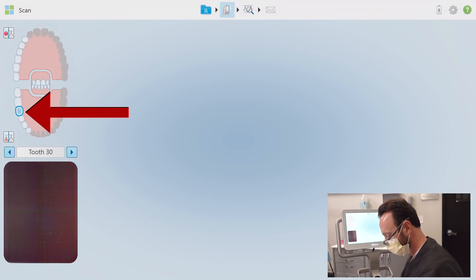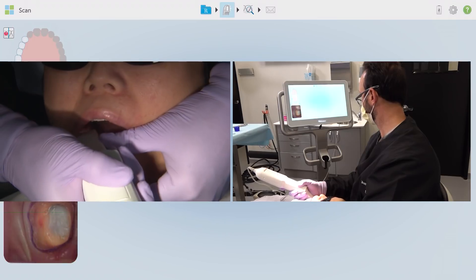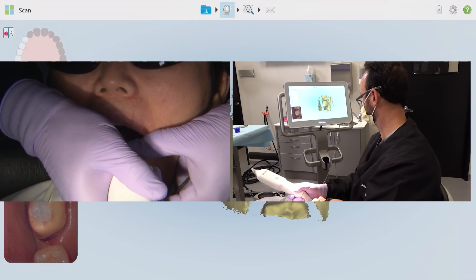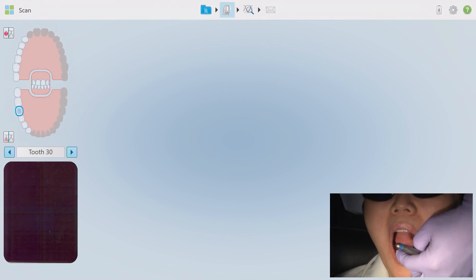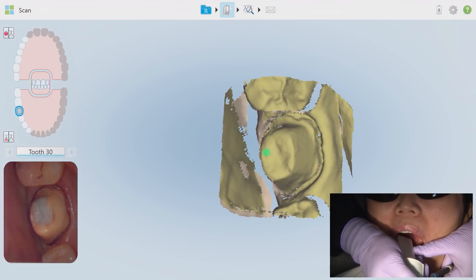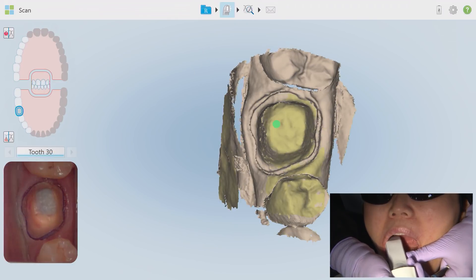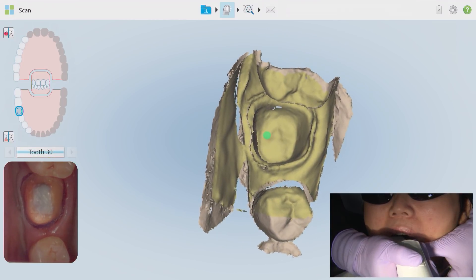Click and select the tooth preparation — it's colored in blue on the chart — and prepare for your first scan. Take a look at my hand position: I'm holding the wand at the base with my dominant hand, palm towards the ceiling. I'm seated at 12 o'clock in relation to the patient and the iTero is set up at either a five or seven o'clock position. This first scan is of the tooth preparation alone — I like to call this the five-second scan. Place the wand directly over the occlusal surface of the prep and attempt in roughly five to ten seconds to capture all details, including the margins, the occlusal surface, and the axial reductions.